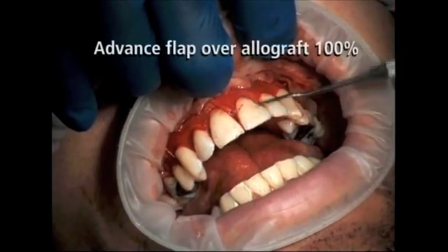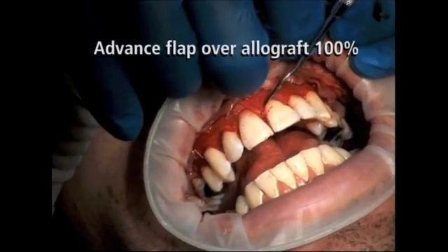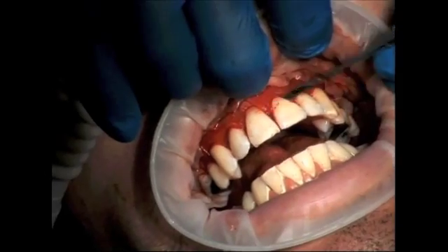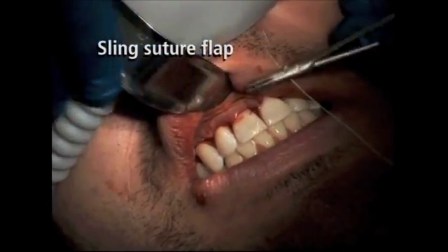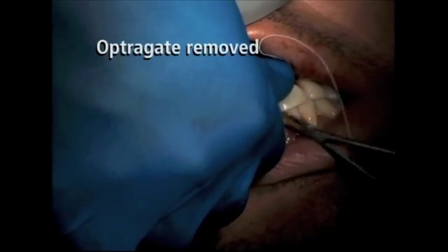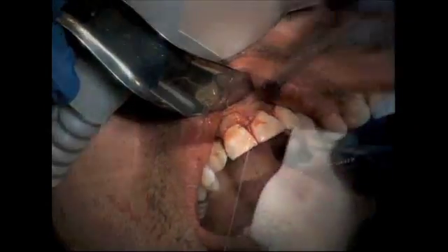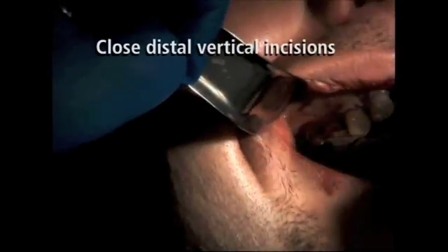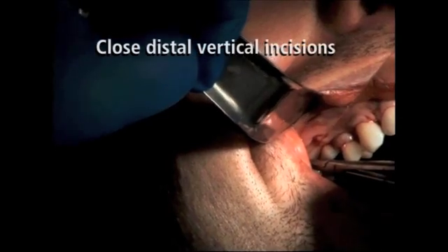It is now time to suture the primary flap, once again utilizing 5-0 Vicryl suture with the independent sling suture technique. It is important to note that in order for this graft to be successful, the entire perioderm graft must be covered by the primary flap. Note how easily and passively the flap is being translated over the perioderm graft. Care should be taken not to put excess tension on the flap. The procedure concludes by securing the distal vertical incisions utilizing 5-0 Vicryl sutures with either an interrupted or continuous suture technique.